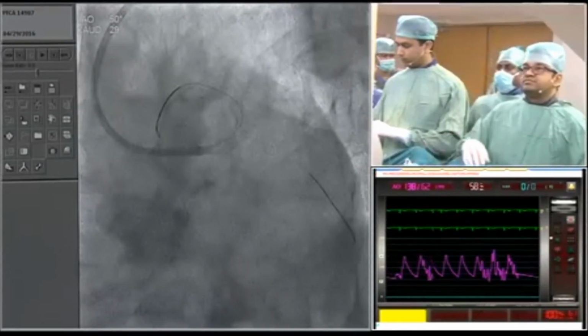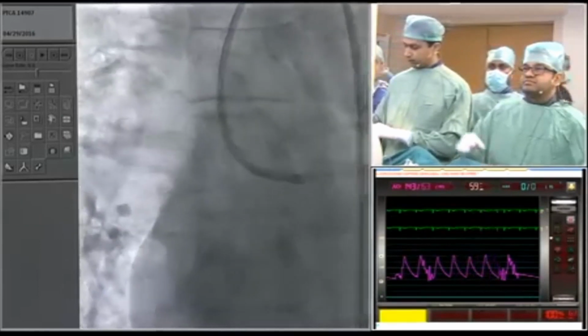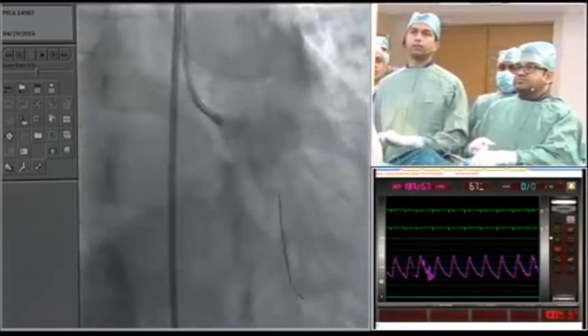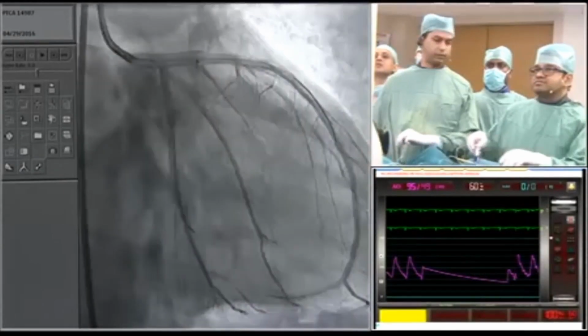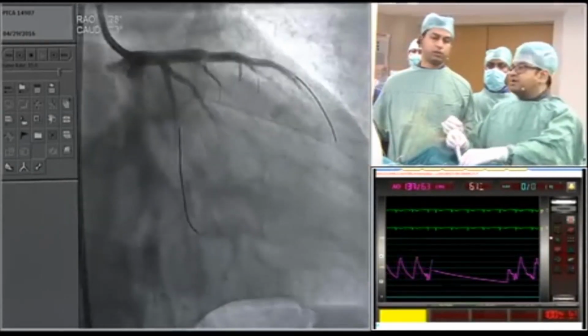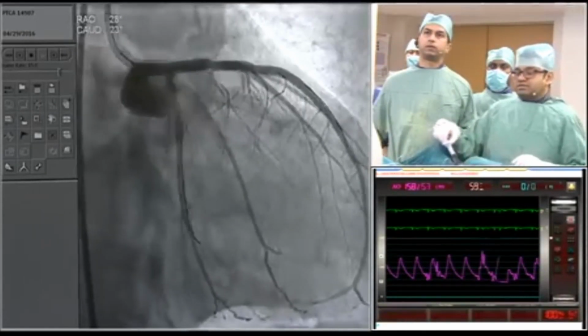We have published in January this year a study with a drug-eluting balloon systematically inflated in the secondary branch with angiographic control, an excellent angiographic control at 6 months. So I do believe that there may be some space with this drug-eluting balloon for bifurcation, and specifically after BVS.